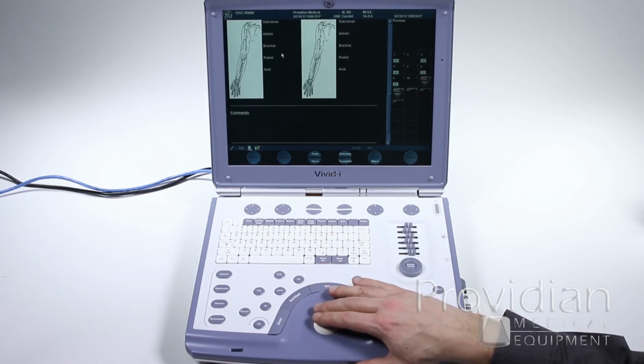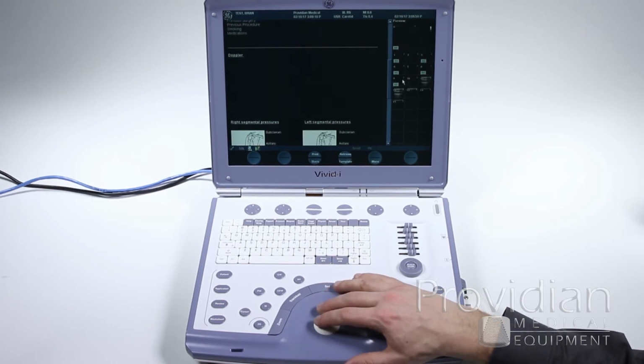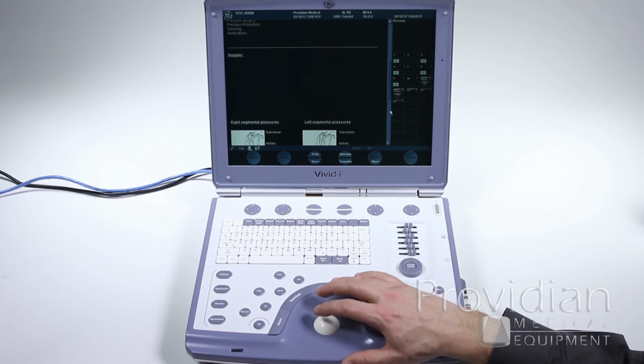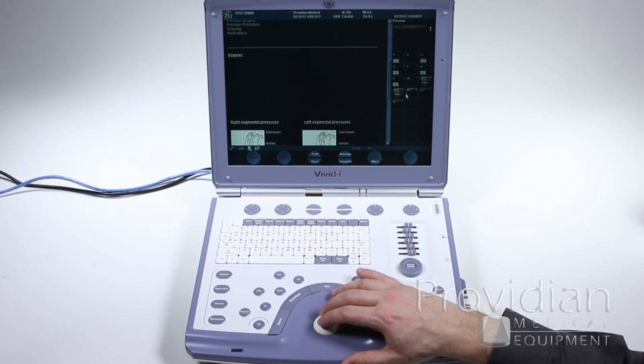So it has all these markings on there for when you want to print it, it can show you where it is. And on some, you'll actually have what's called a container where you can choose images, double click on it, and it will add to the report. This particular template does not, and some machines don't actually do that. Later versions allow you to just double click or drag and drop these over onto one of the reports.